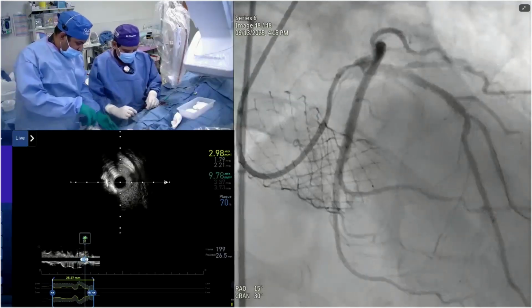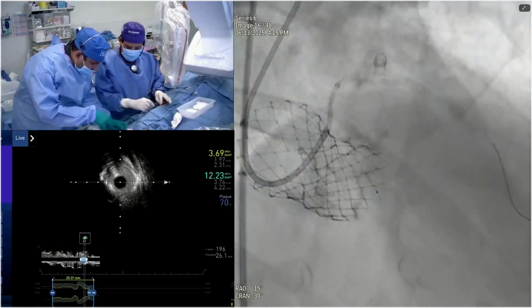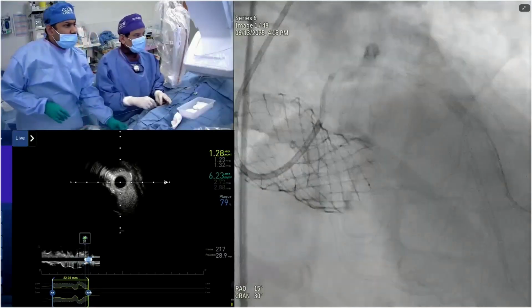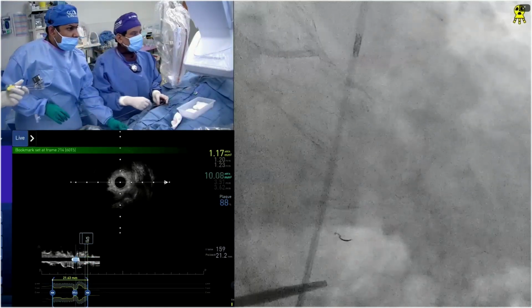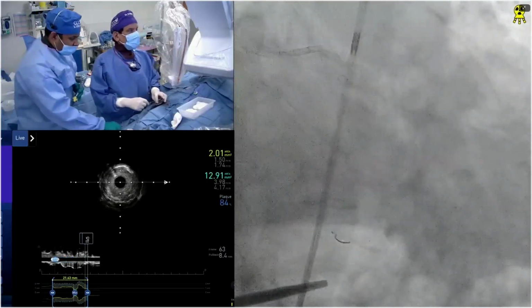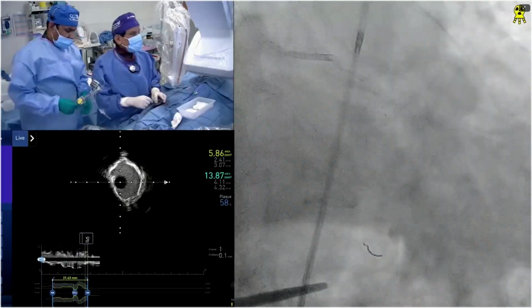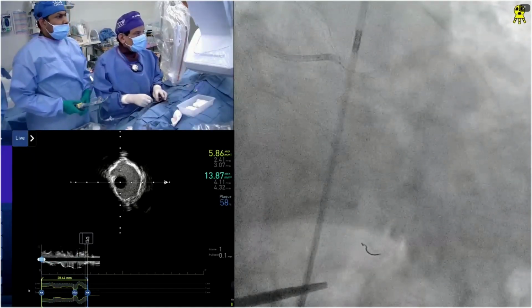our published paper in 2018-19 in the JAC on how to engage the coronary arteries, and of course then intervention with the various catheters. And we made the very clear-cut point that you will need this in these cases, particularly more so for the self-expanding valves, that you may end up using the guide liner the way we are using right now.